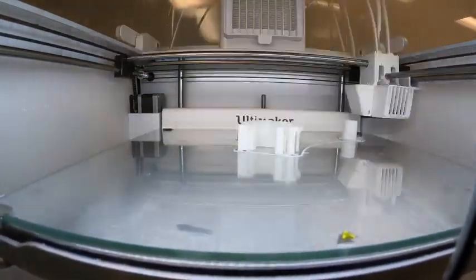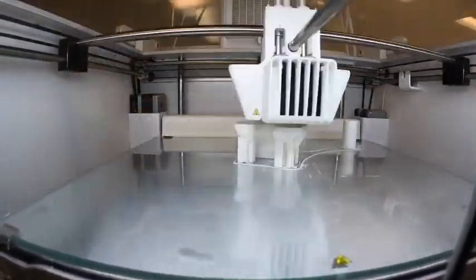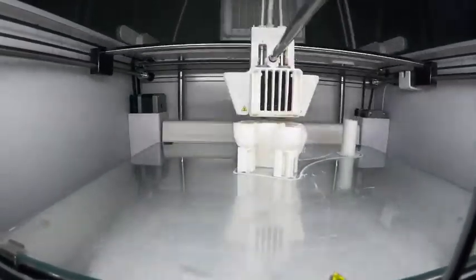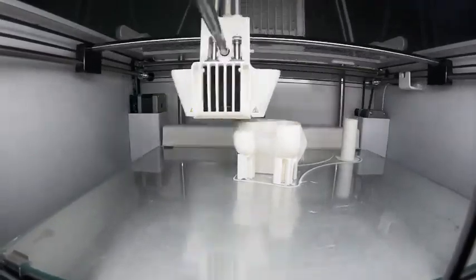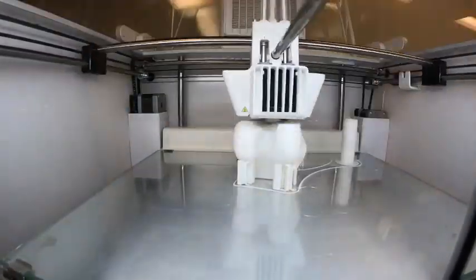On this model we can simulate procedures such as trochleoplasty. Here we show the 3D print production of a distal femur from a 27-year-old female with trochlear dysplasia and recurrent patellofemoral instability. A CT was obtained of her right knee, from which her bony anatomy was segmented using Materialise Mimics, and cartilage was extrapolated using anatomic reference.